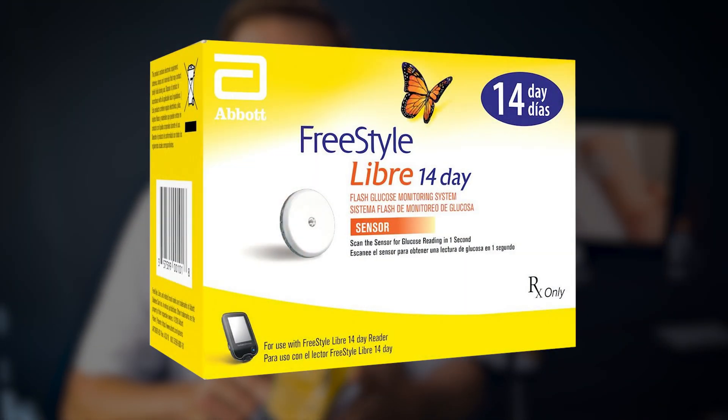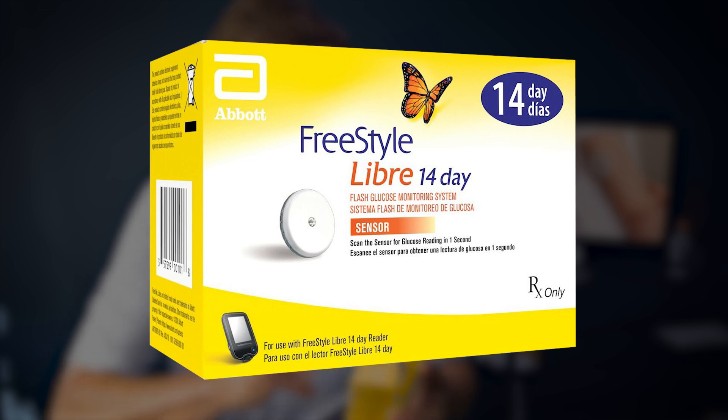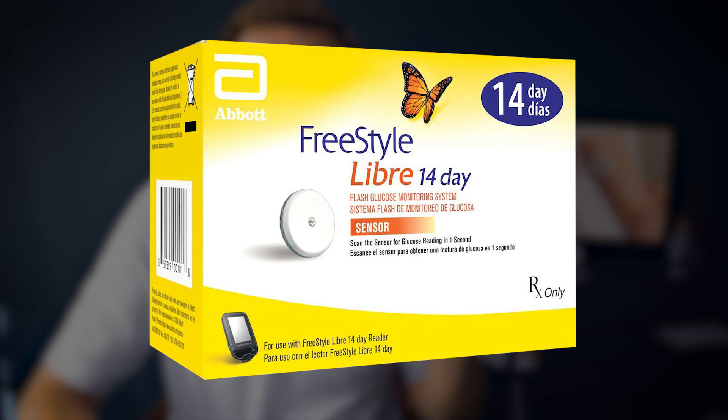Hello everyone, Dr. James Markham here with another Biblical Prescription for Life. Today we're going to be very practical and we're going to show everyone how to use and apply the Freestyle Libre, which is a monitoring device for diabetics.